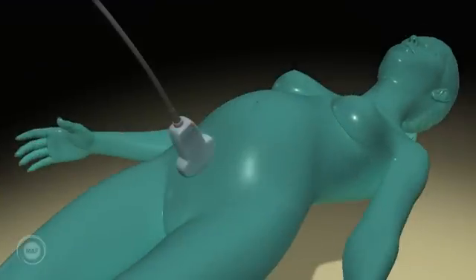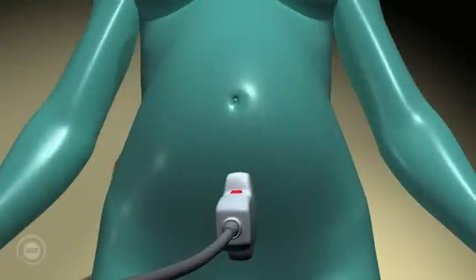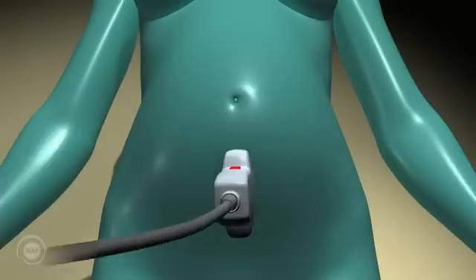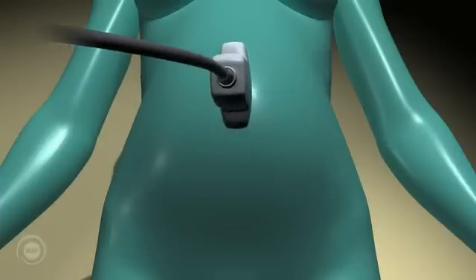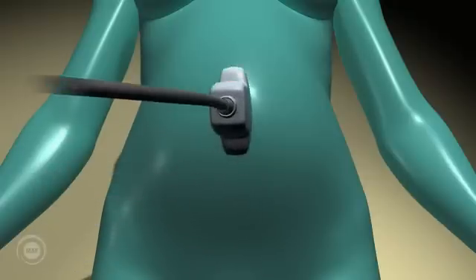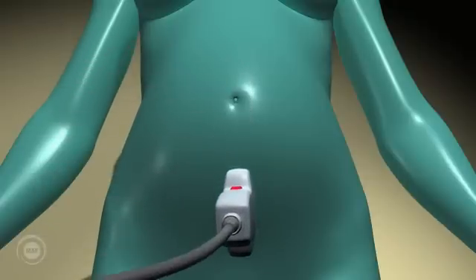Longitudinal. When initiating a scan, one always starts with a probe over the pubic bone of the mother in a longitudinal plane. This means the long axis of the probe is lined up with the long axis of the mother. We then scan systematically up and down her abdomen, taking slices lengthways.